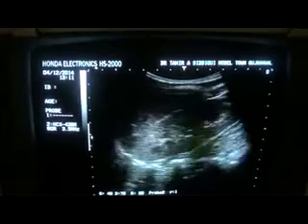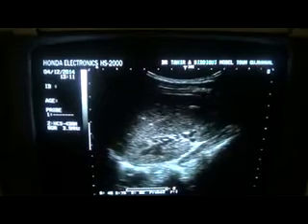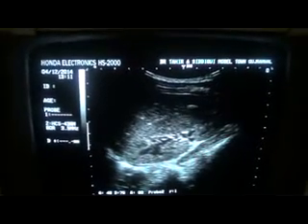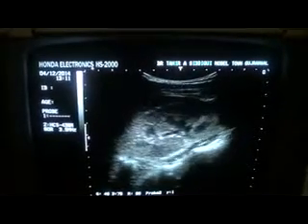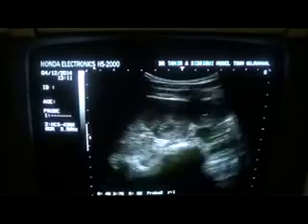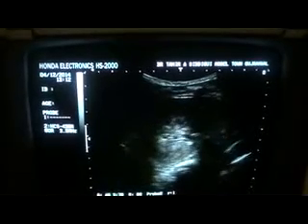So, this is how we study. There is no focal lesion seen. This is the upper pole, no adrenal region pathology seen, no calculus seen, no significant hydronephrosis seen. The proximal ureter is not dilated. If you want to study the proximal ureter, it is not dilated.